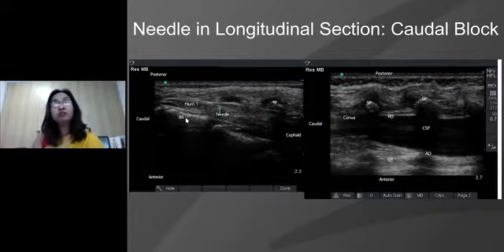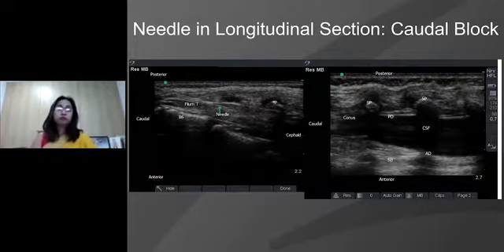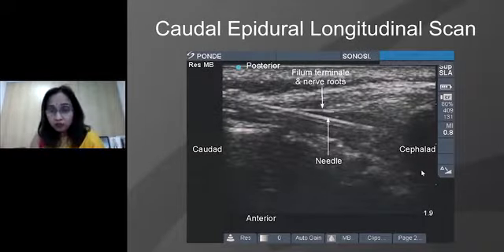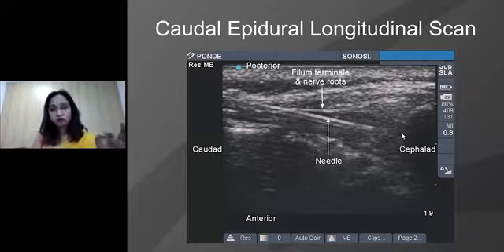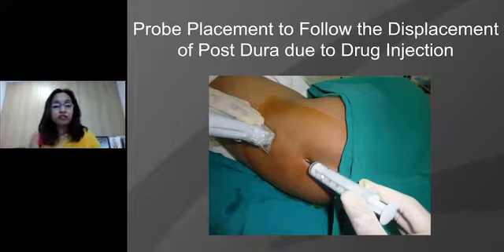That gets prevented here, and now the needle is in the correct place, not too close to the conus as well, and we can very safely inject the drug. So here is the conus, which we are just about to puncture, but we cannot, or we should not, because we can see it. Well, having injected, what else does ultrasound really open up?